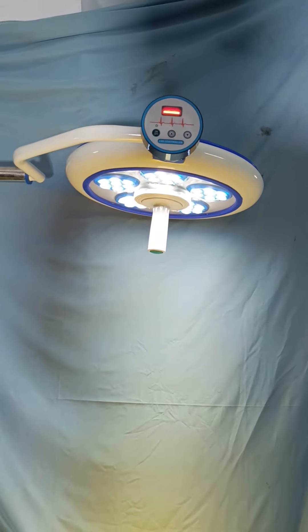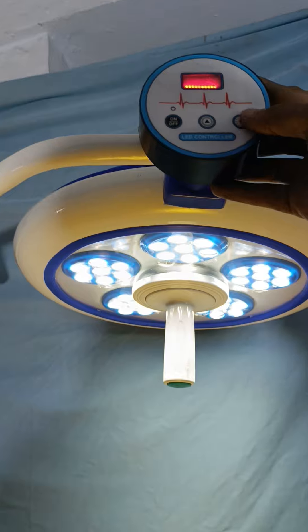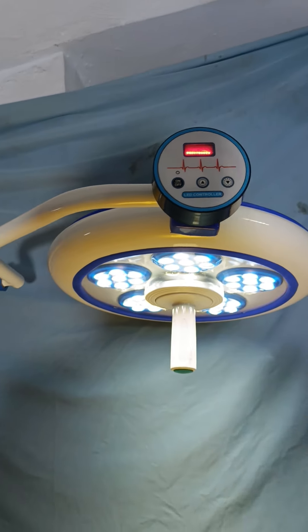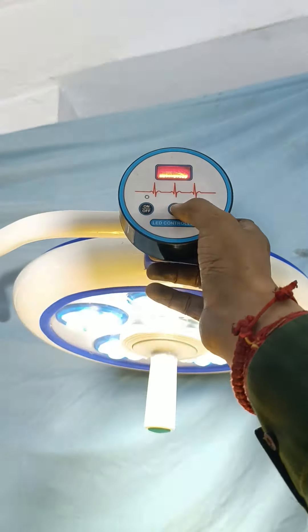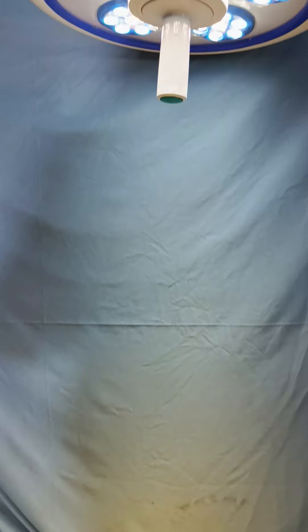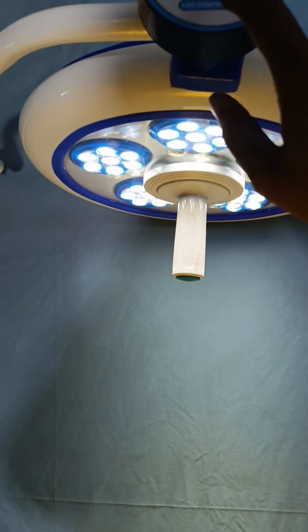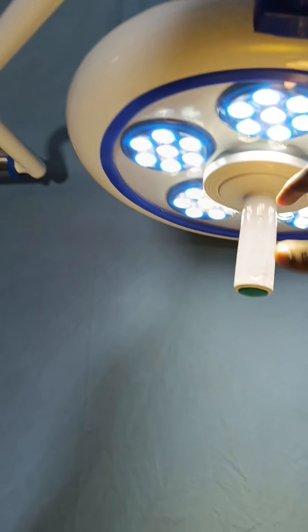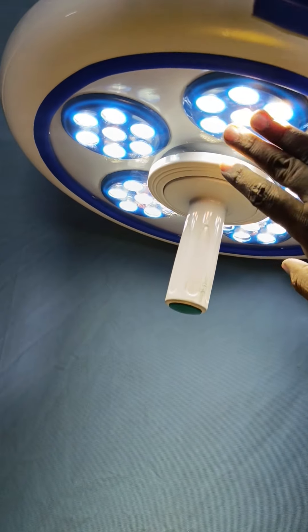This is our aluminum body Eco 35 with the digital controller, working both manually and by remote. It is also working by remote and manually. You can see that it has polycarbonate sheet glass to cover the lens and LED.